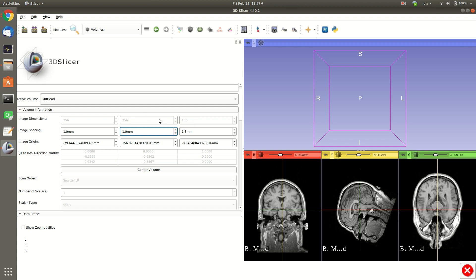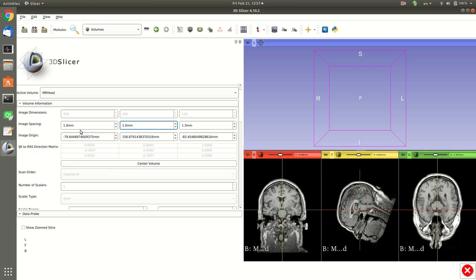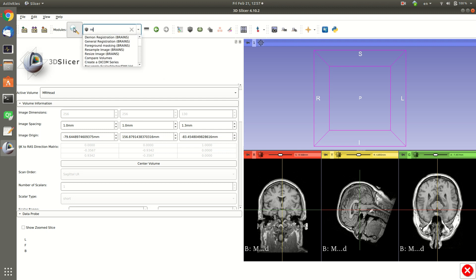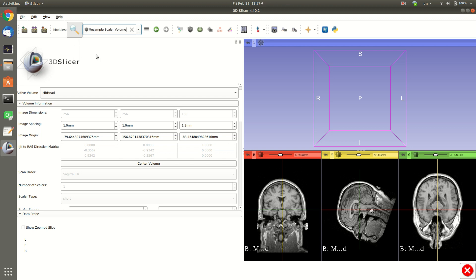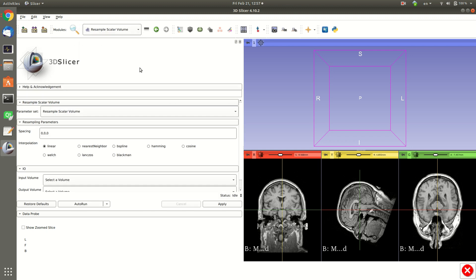So to get an isotropic size of this image, basically what we do is we change the spacing to make it also one here instead of 1.3. For this there is a module called Resample Scalar Volume as you can see here.